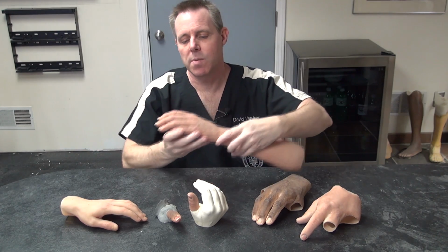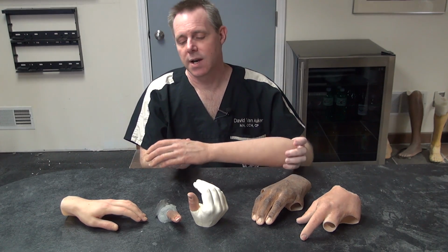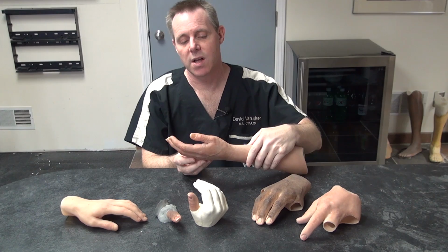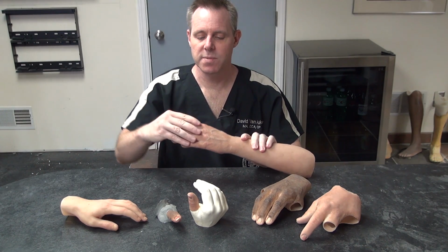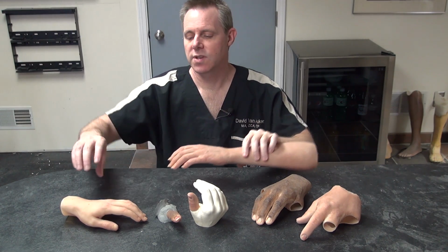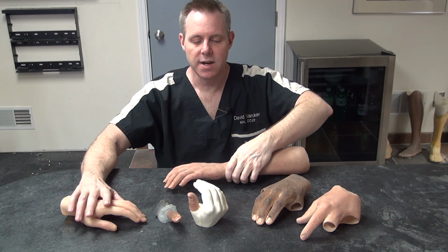We've got a below elbow prosthesis here. This is actually a passive arm. I'm not talking about electronics or powered prosthetics at the moment, though we do have information on that as well. This is designed purely for aesthetics. It has wires in the fingers to be positioned, but it's really not intended to be used for more than just appearance.